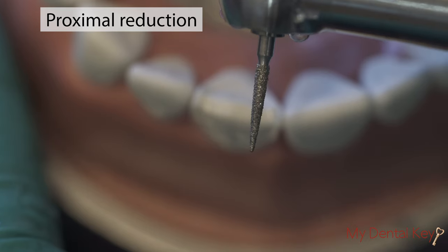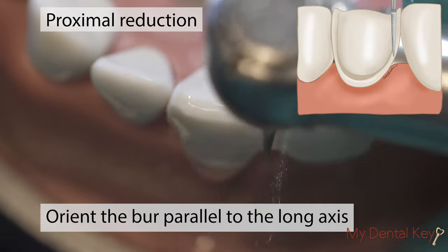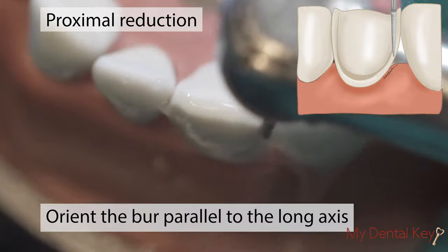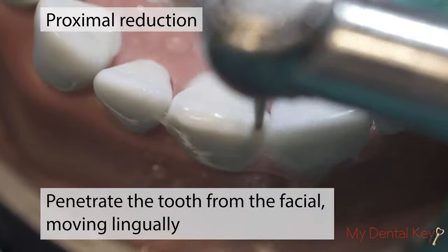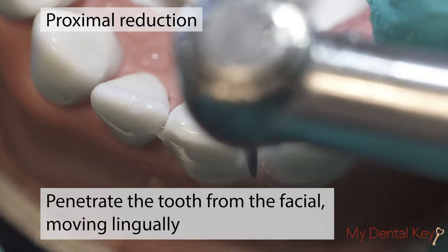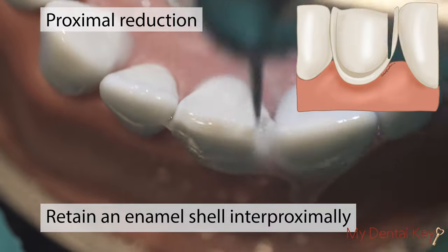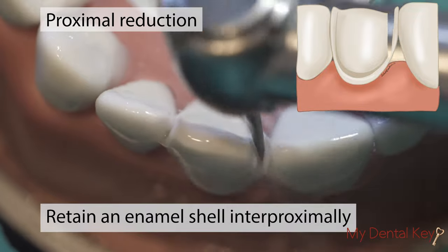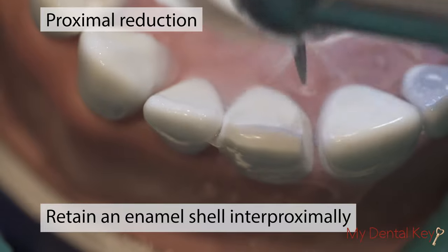The proximal reduction will be completed in a series of steps, which are as follows. The first step is to orient the burr parallel to the long axis of the tooth on the facial surface, beginning with either the mesial or the distal side. Penetrate the tooth from the facial and move the burr lingually in a sawing motion. Be careful to avoid the adjacent teeth. To avoid the adjacent teeth, it is helpful to retain an enamel shell of the proximal tooth structure while splitting the proximal contact. Once the burr moves smoothly from the facial to the lingual, remove the enamel shell, either using your burr or a hand instrument.